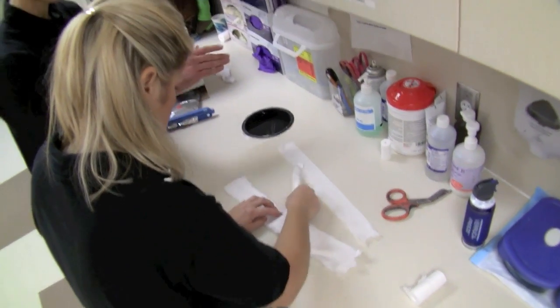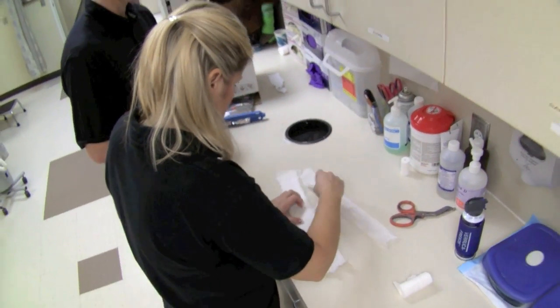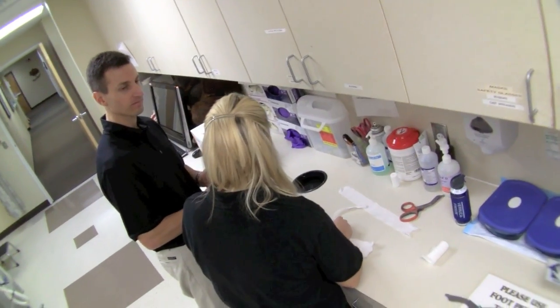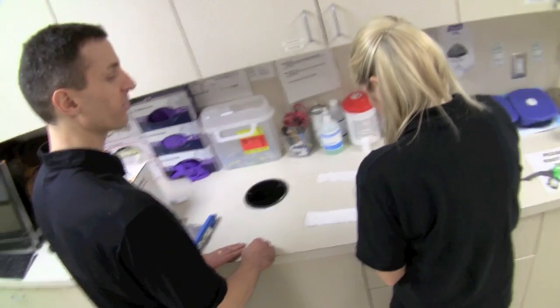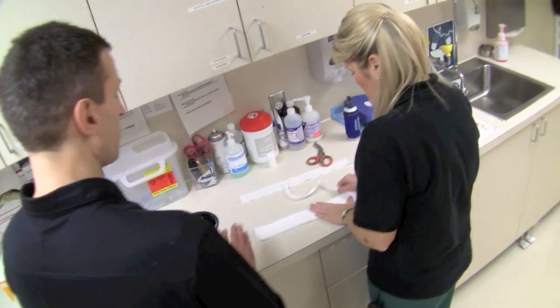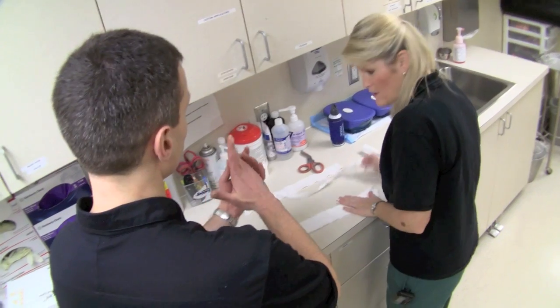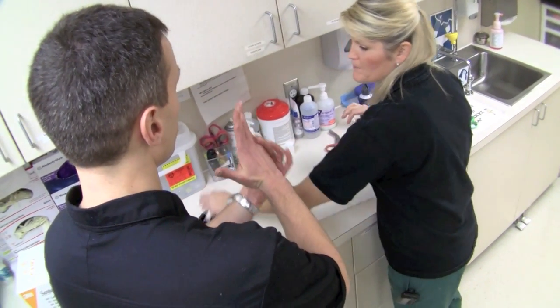What size of fiberglass are we going to be using, at least for my size of arm? I would typically use a three-inch fiberglass. And is that so that you're able to cover these fingers? Correct — both volar and dorsal.